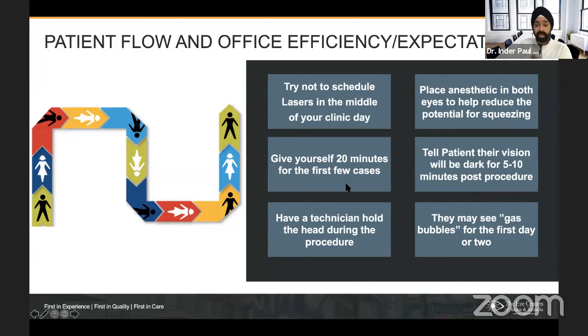Yes, I have done it in patients with diabetes, but not active DME. So if they have active DME, I tend to make sure that we use the intravitreal injections if we need to, or focal laser. I try that first if we can, because I feel like there's less chance of causing a problem. Now, I have done people with VMT, vitreomacular traction, people with ERMs, and we have not seen an exacerbation of any ERM or CME inducement from the laser as well.